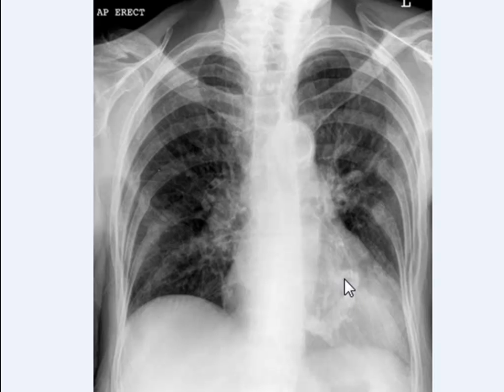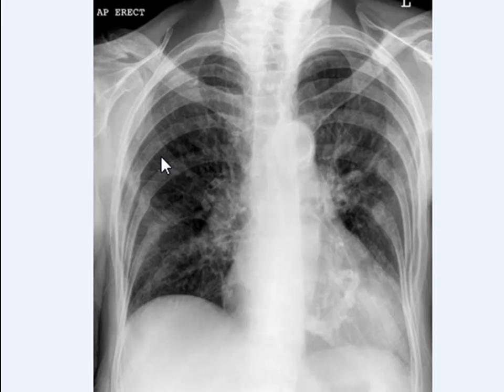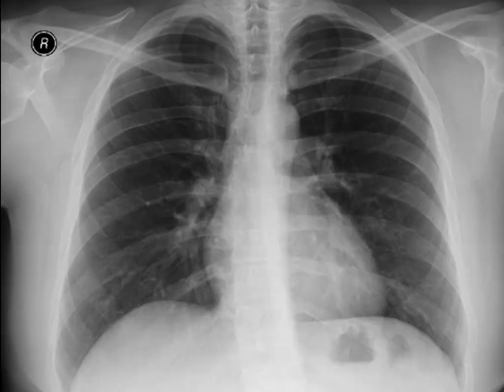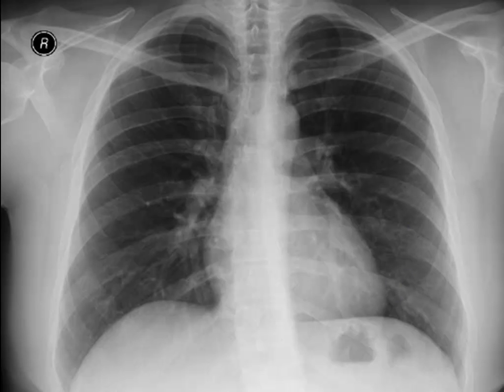He has calcification in the mitral valve and some calcification in the arch of the aorta. If you look at the lung parenchyma and go back, this is a healthy young lung parenchyma — that's how it looks like.